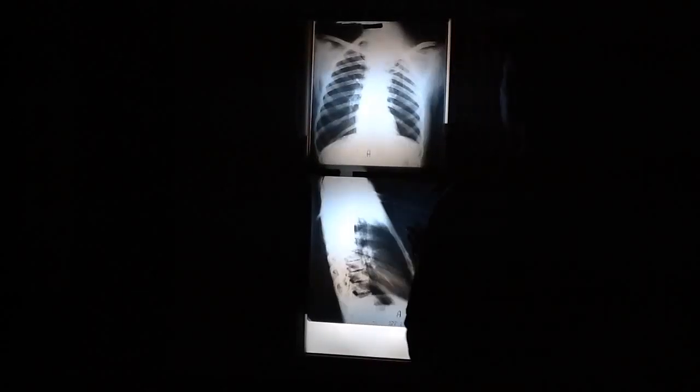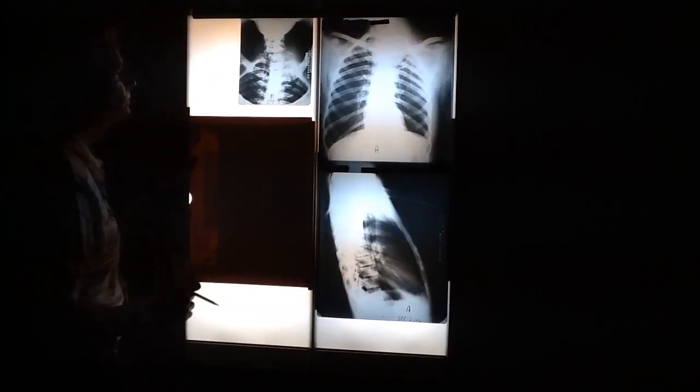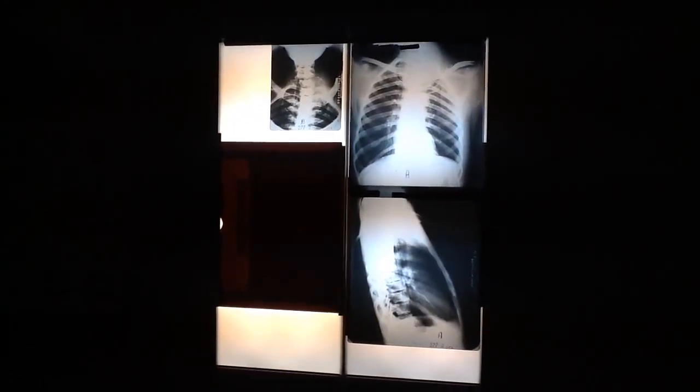Good. In fact, there is a bone film here. Let's just put that on. Nice. All right, so trachea displaced.